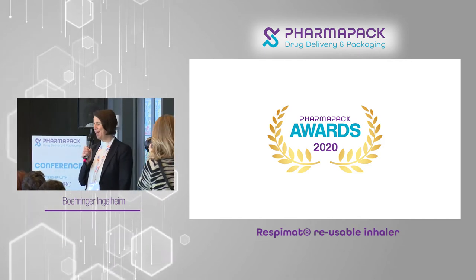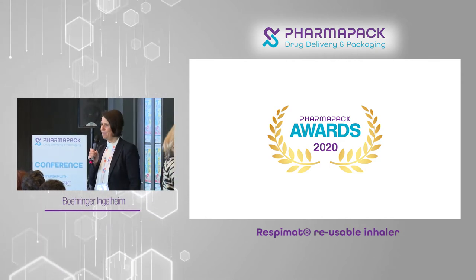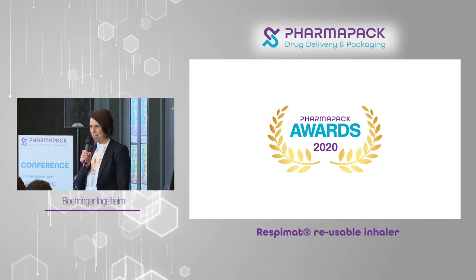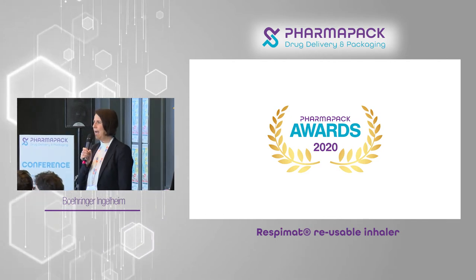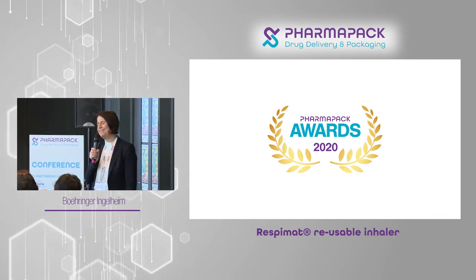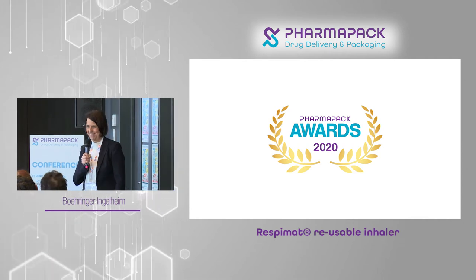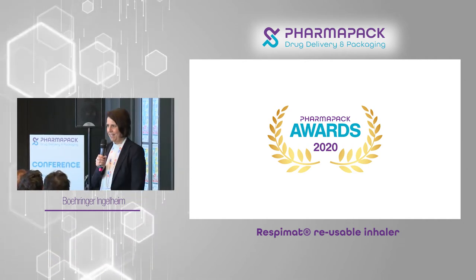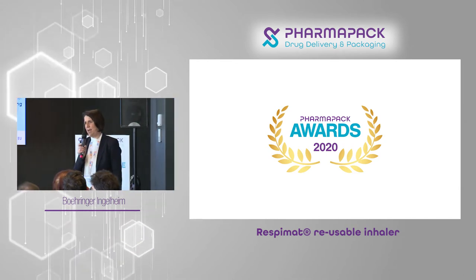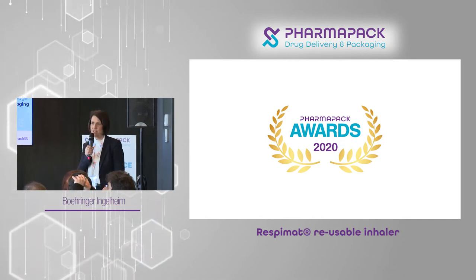More, so we made studies, and it could be up to 9 or 10, but we make it a little bit safer, so we said okay, it's up to 6, so we registered for 6. The limiting factor for us is a design factor, the nozzle design. It could be that we have clogging problems, but there's no potential, we limited it to be on the safe side.